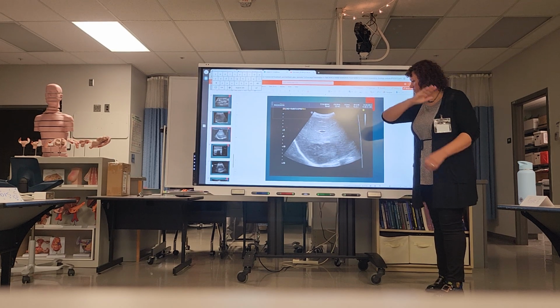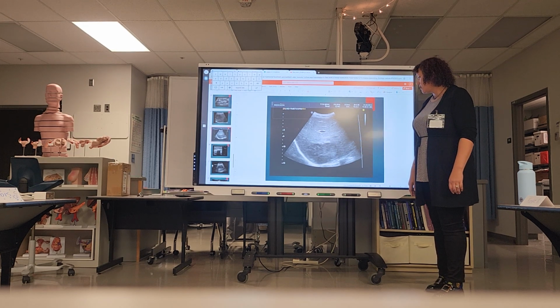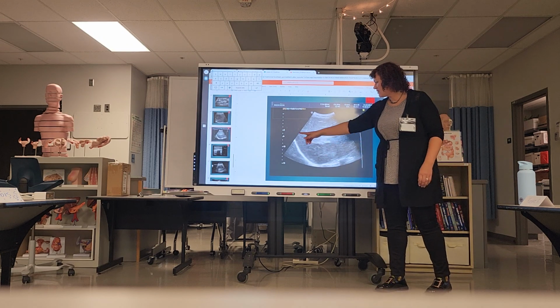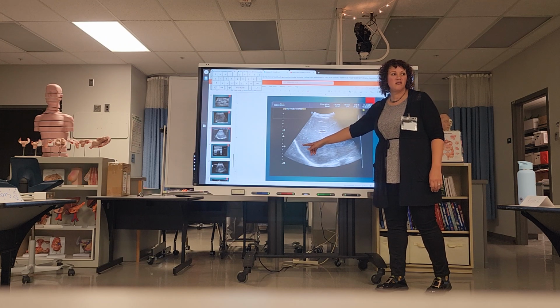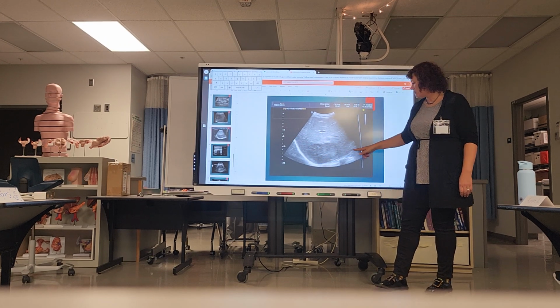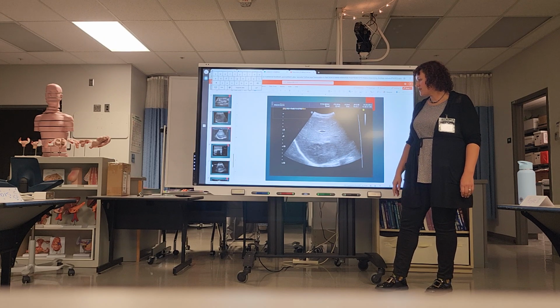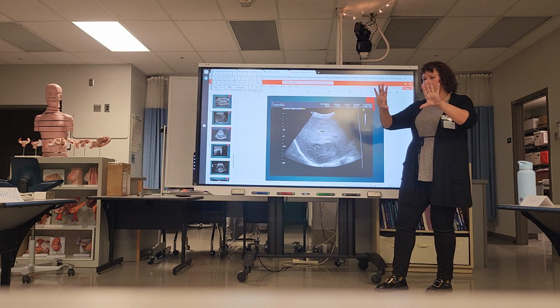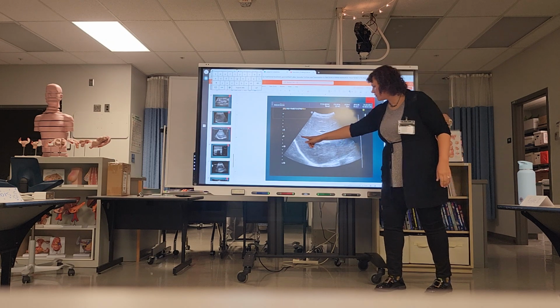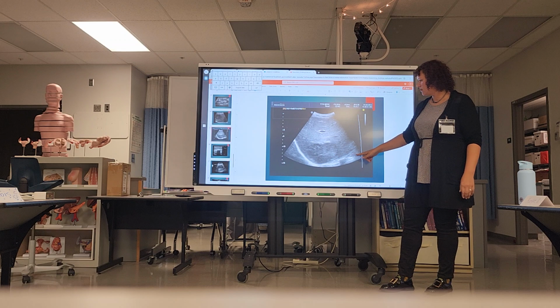And it's a sheath. So it'll look like this in transverse and in sagittal. It'll just be this echogenic line like this. We'll never see it like a flat piece. It'll always look like this, no matter what plane you're in.